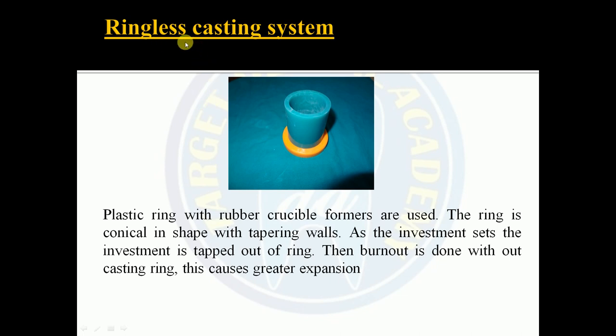This is something called the ringless casting system. In this, a plastic ring with a rubber crucible former is used. The ring is conical in shape with tapering walls. As the investment sets, the investment is tapped out of the ring. Then burnout is done without the casting ring. This causes greater expansion.